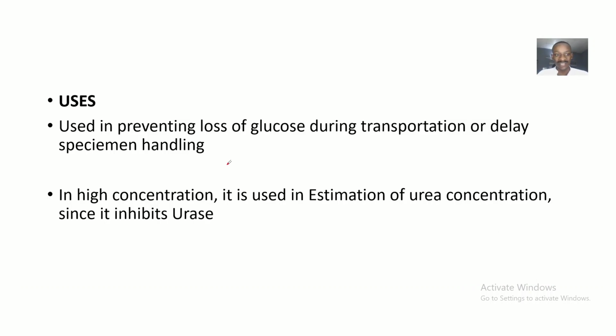Now, what are the uses? It's used in preventing glucose loss. That's loss of glucose during transportation or delayed specimen handling, all right? Probably you collected a specimen today and you want to handle it tomorrow or assay for it tomorrow. Then you might want to add sodium fluoride if you need the glucose content to be preserved, all right?